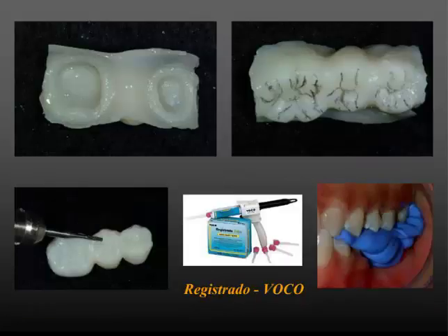Here's the provisional after it's taken out of the stent. In my provisional courses where we do hands-on, I always have the students draw the teardrop-shaped cusps in the proper position. Here you see the mesial lingual to distal buccal cusp. The mesial buccal and distal lingual — they don't touch. Then using a 557 straight fissure burr, you just erase the lines.